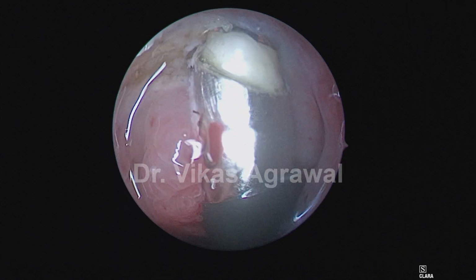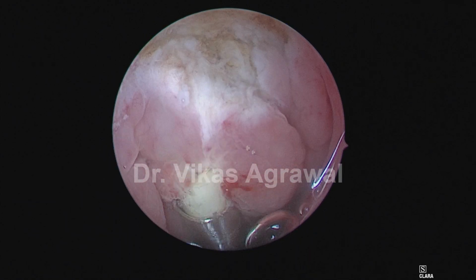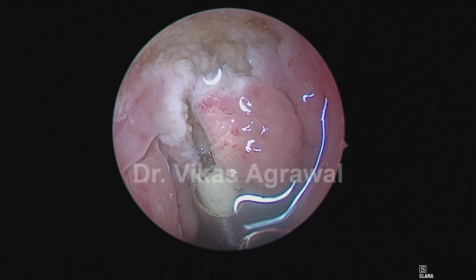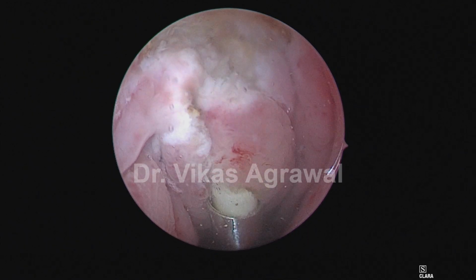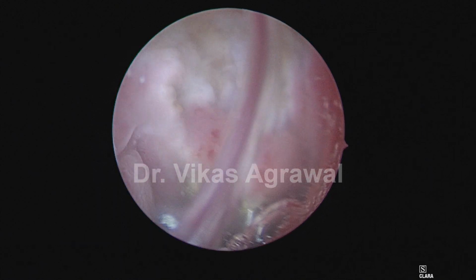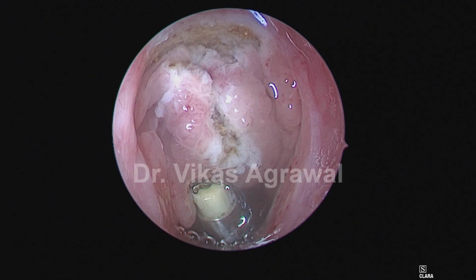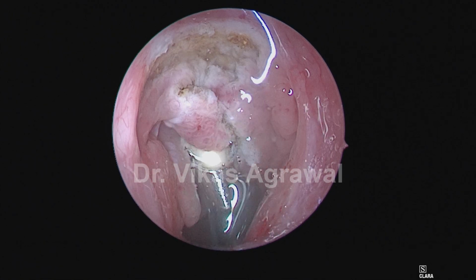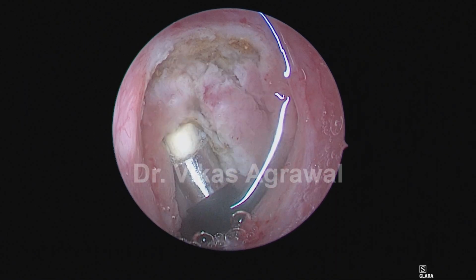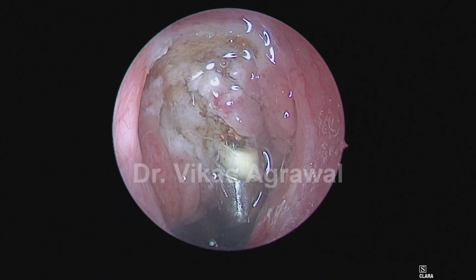Now that's the superior boundary completely defined. I'll go layer by layer, create some space for myself. Now you can see that there's a lot of space created. And now I can move the wand a little more freely than before.